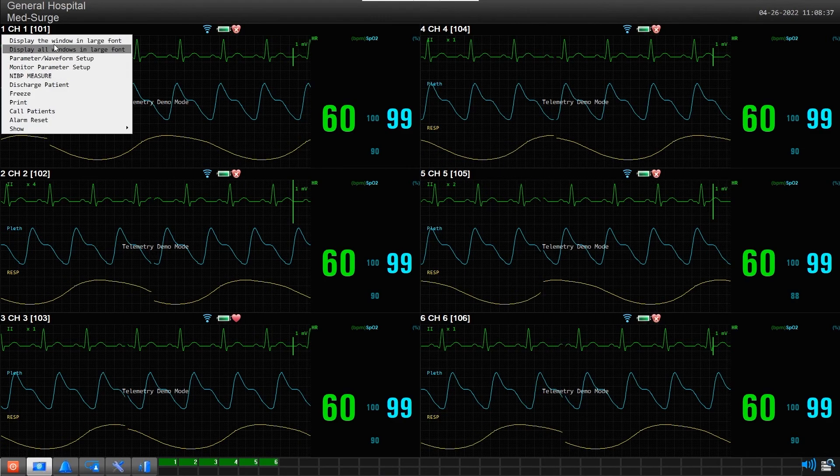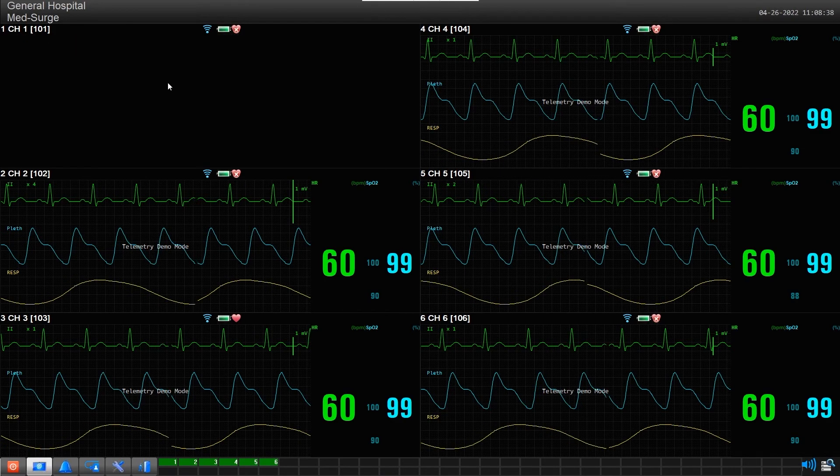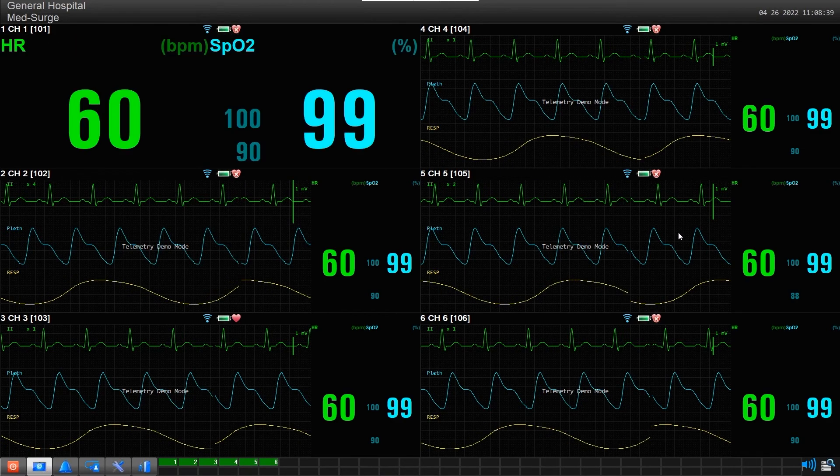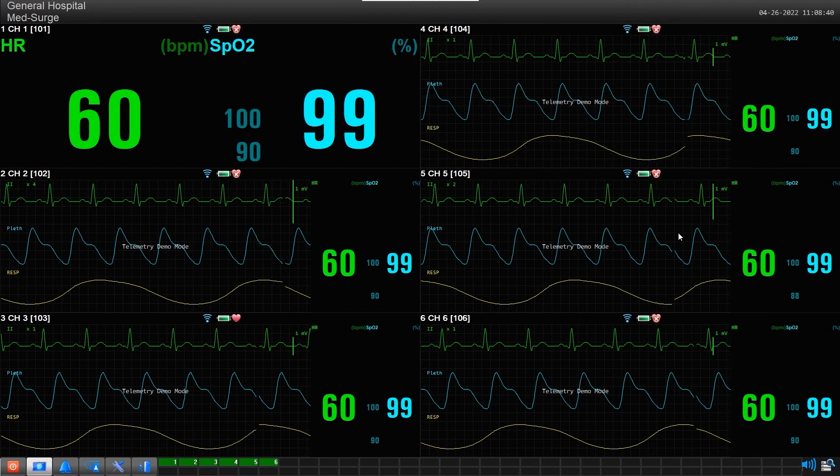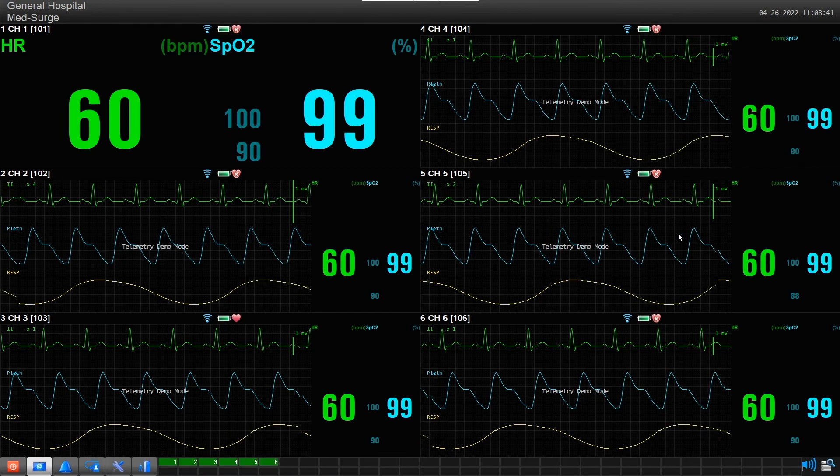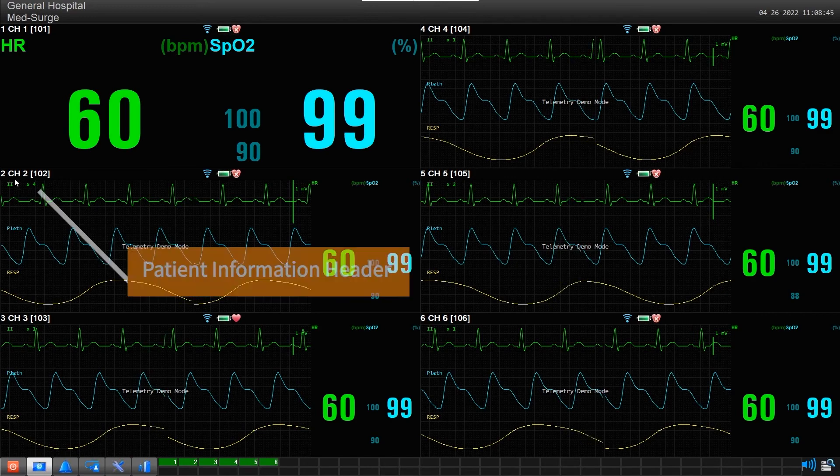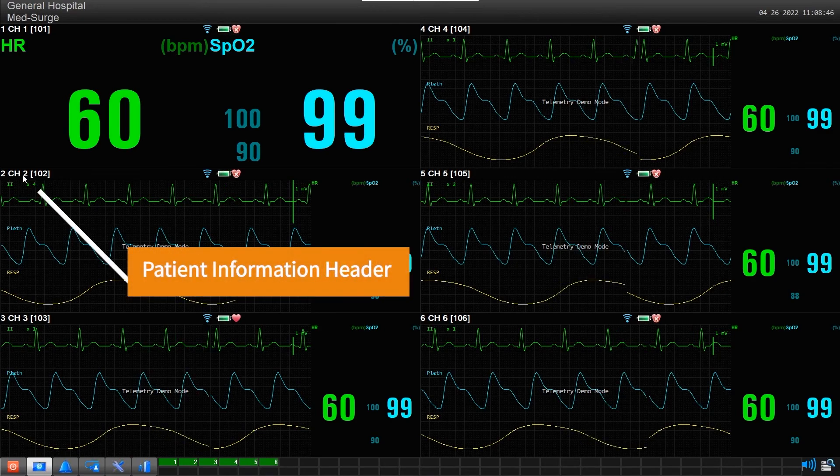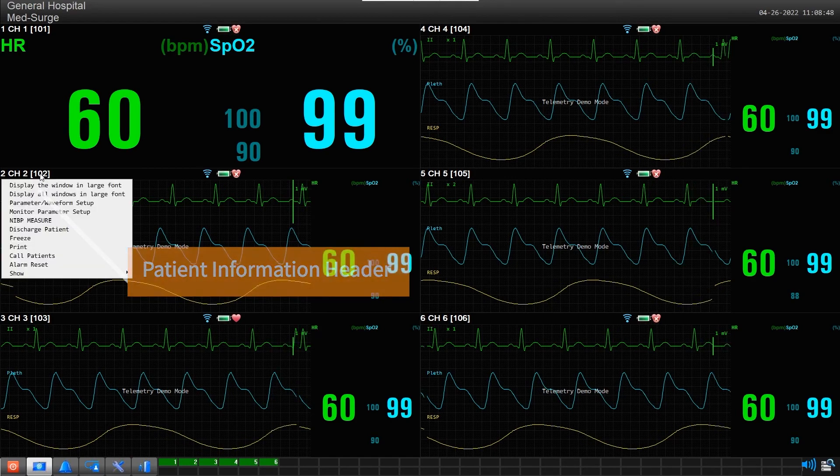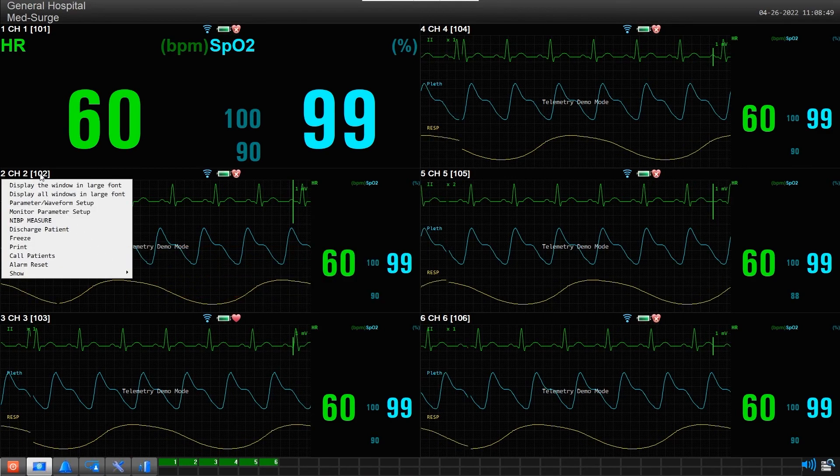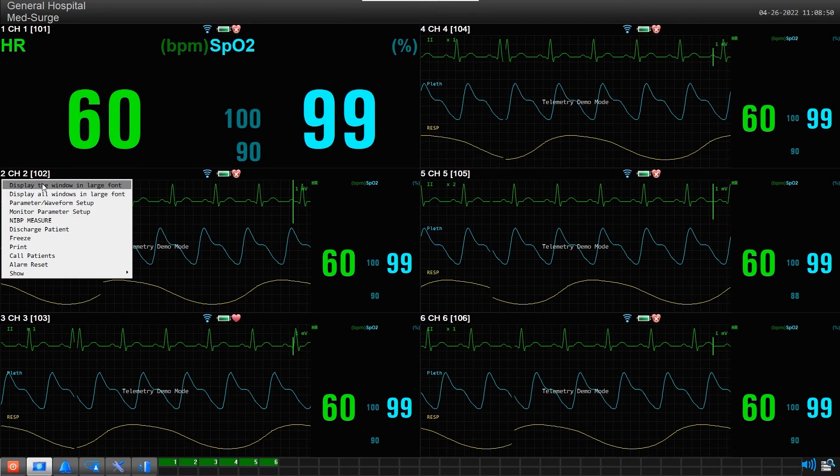It does this by not displaying the waveform data. To turn Large Font Mode on or off, first click in the Patient Information header or in this general area. You will now see two command lines for Large Font Mode.